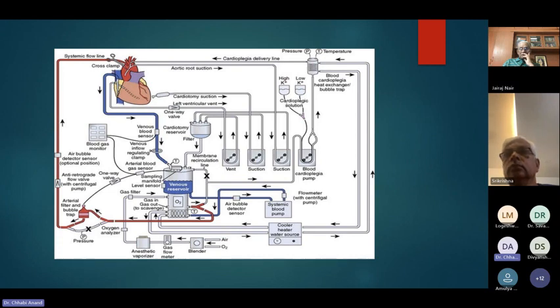The cooler heater water source may be operated to supply water to the oxygenator, heat exchanger and cardioplegia delivery system. The air bubble detector sensor may be placed on the line between the venous reservoir and systemic pump, between the pump and membrane oxygenator inlet, or between the oxygenator outlet and arterial filters. A one-way valve prevents retrograde flow. Other safety devices include an oxygen analyzer placed between the anesthetic vaporizers and gas inlet, and reservoir level sensors attached to the housing of the hard shell venous reservoir.